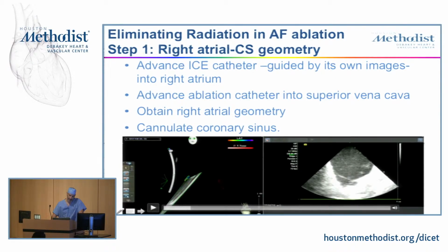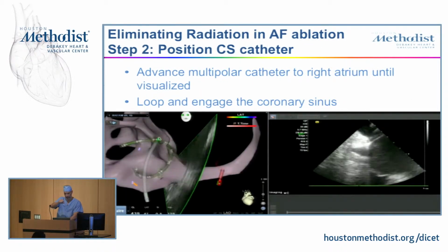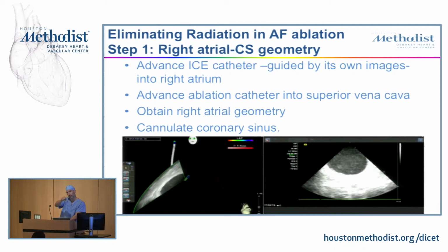The system can identify the catheter tip and its location, not just in XYZ, but also within a given location, it can tell whether you're rotated like this or like this. So it knows XYZ, but also the yaw, pitch, and roll. So 6 degrees of freedom. I know where I am and I know where I'm facing within that position. I know where the tip is moving.